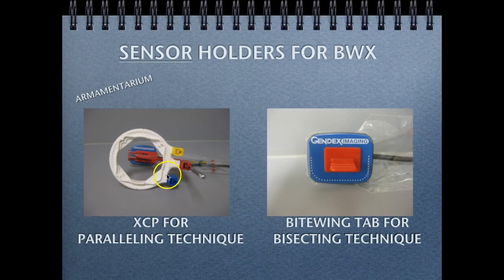Sometimes if the patient's teeth are not in perfect alignment, maybe their facial features, they're not like textbook, so sometimes you might have to set your PID, what we call, off the ring in order to get that diagnostic quality image. Or a tab might be used.